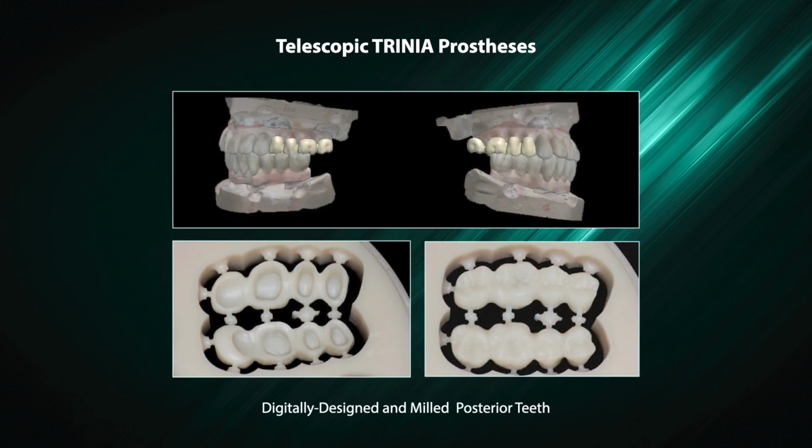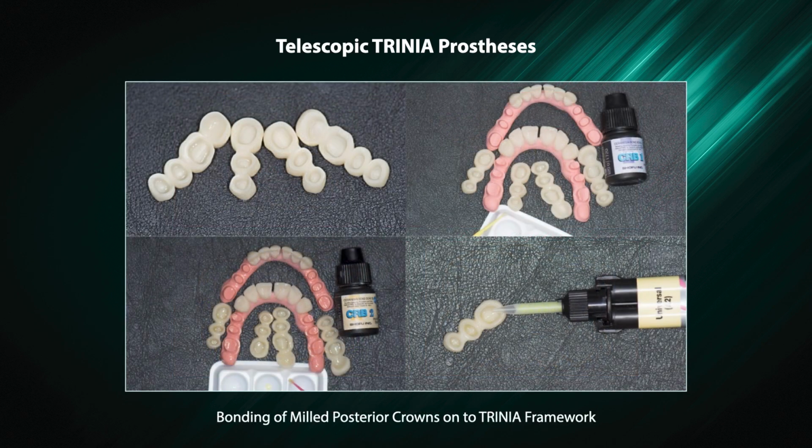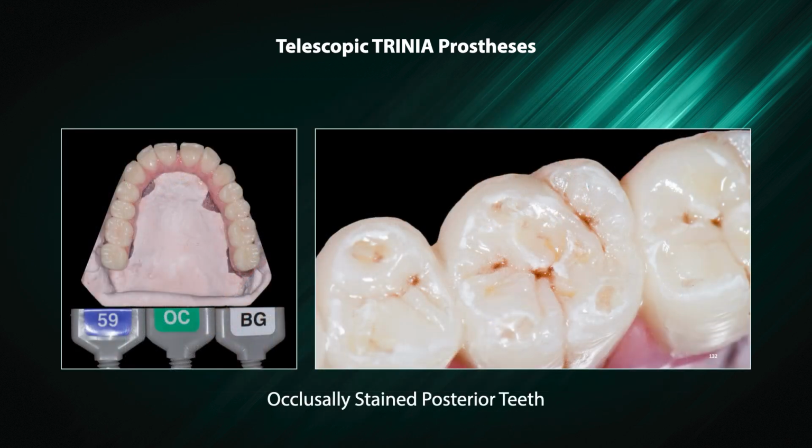Digitally designed and milled posterior teeth. Bonding of milled posterior crowns onto a TRINIA framework. Occlusally stained posterior teeth.